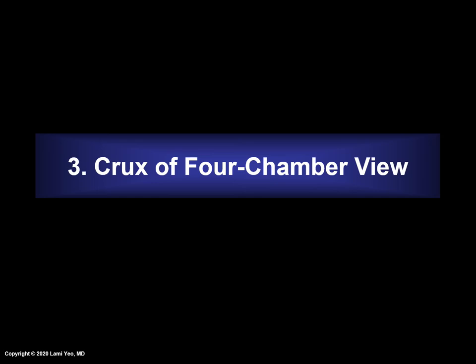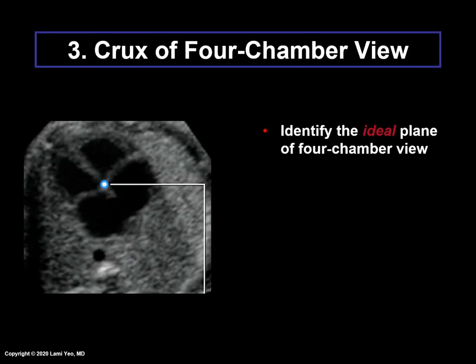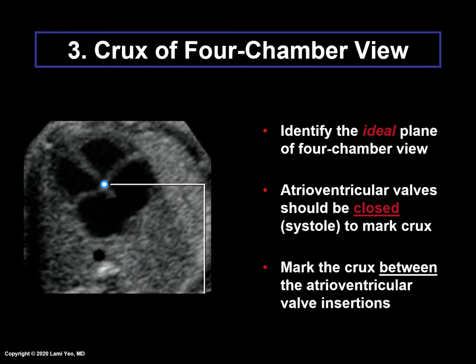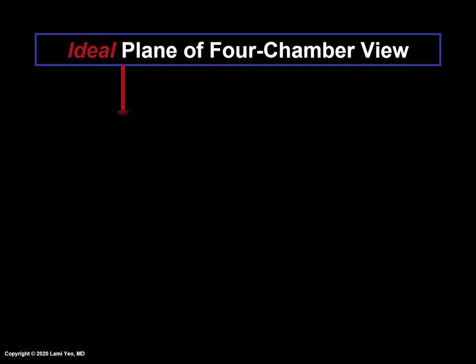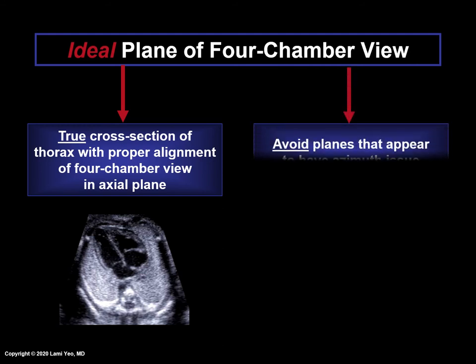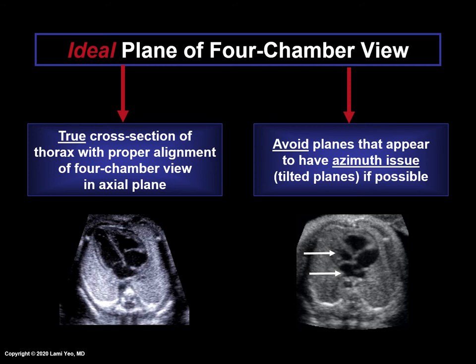Crux of the four-chamber view: to mark the crux, identify the ideal plane of the four-chamber view — the same plane used to mark the aorta. The atrioventricular valves should be closed in systole. Then mark the crux between the atrioventricular valve insertions. An ideal plane is a true cross-section of the thorax with proper alignment of the four-chamber view in the axial plane. Avoid planes that appear to have an azimuth issue or tilted planes if possible. Azimuth is recognized by visualizing a foreshortened atria or ventricle.